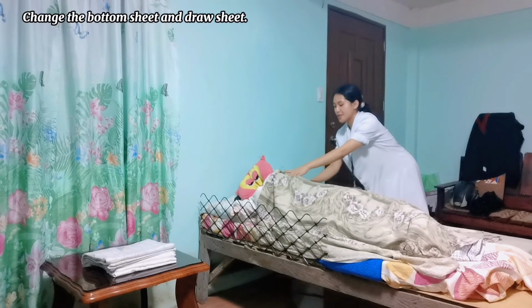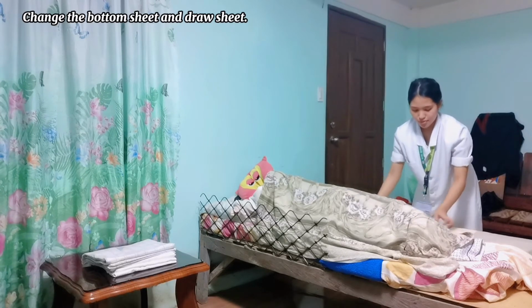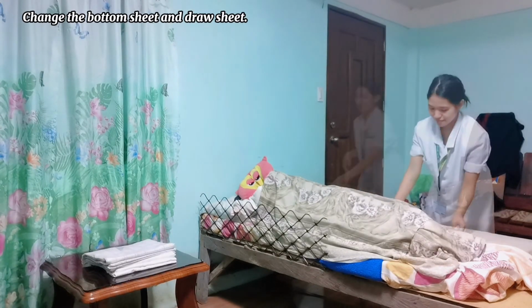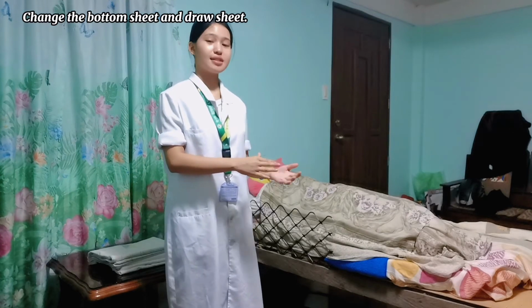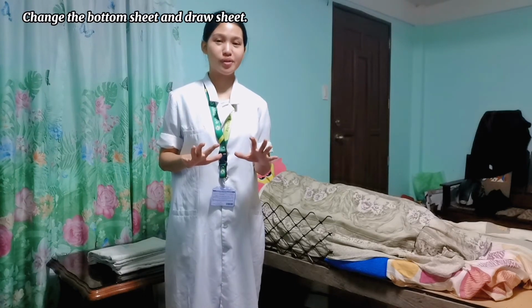So again, ensure the client's privacy and his dignity. Make sure not to expose the body of the patient. So after moving the client to the clean side of the bed, I have to perform hand hygiene and don new gloves.